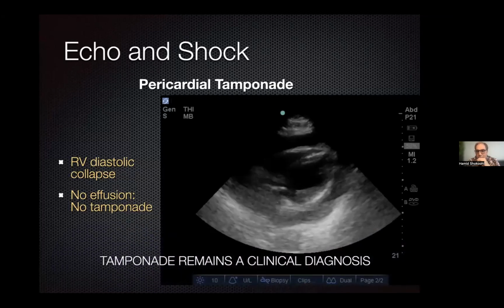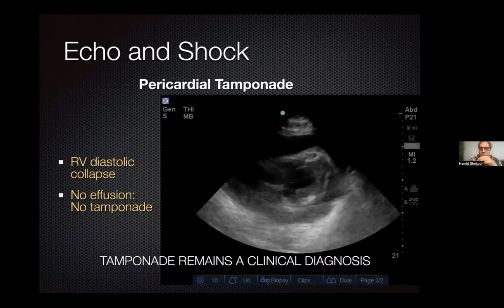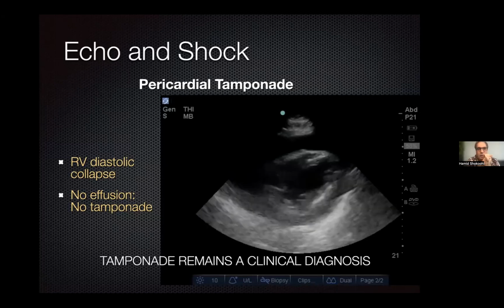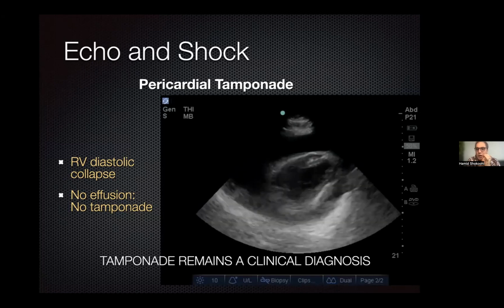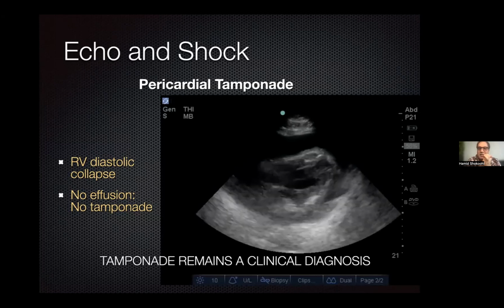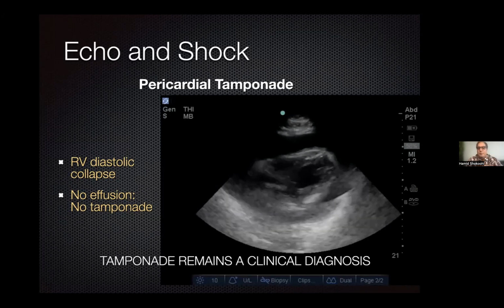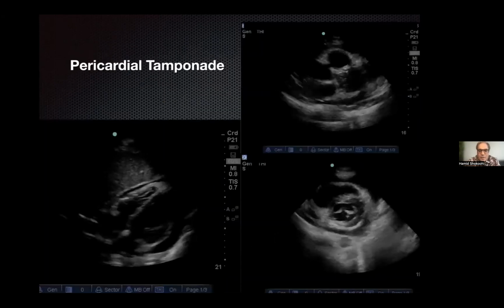Okay. So next we focus on another obstructive one, the obstruction around the heart itself. So it's obstructing around the heart, but the flow is not going around the heart. Why do you call that obstructive? It is obstructive because it is causing pressure on the RV and is not letting the RV fill. So that is the reason for this one: it is tamponading and causing the patient to have low blood pressure and shock as a result. These are the key cases of the RV.